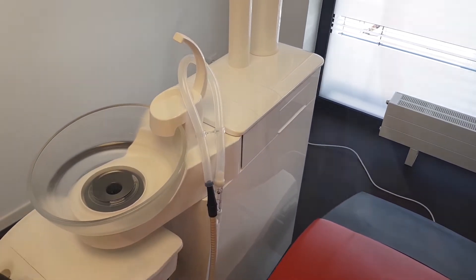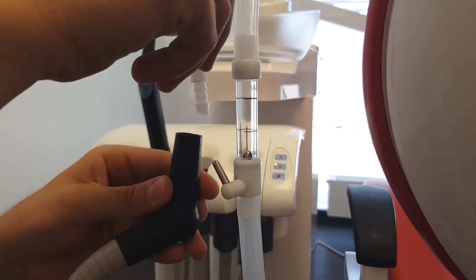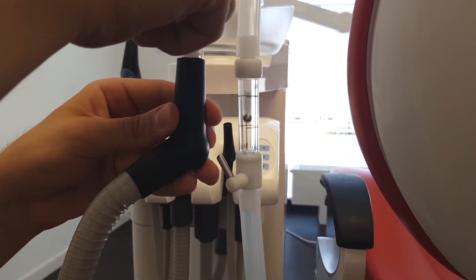In this video we will share with you the adjustments and function of the suction system and our vacuum control block.